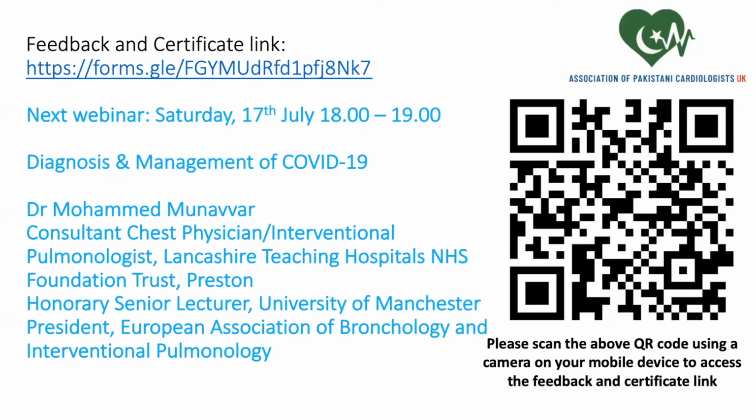I have visited places where there is very high use of intracoronary imaging, and I learned from the person doing it that about 90% of PCI is OCT guided, and it becomes so quick, so slick that it doesn't take extra time. And in most cases, you will be able to make some changes in your decision making. As for why we don't see much improvement in outcomes, current drug-eluting stents and dual antiplatelet therapy are so good that the majority of people will probably be okay even if you haven't got a 100% good outcome from your angioplasty.